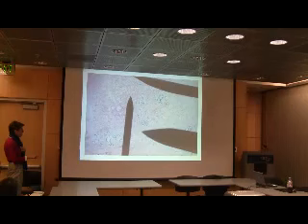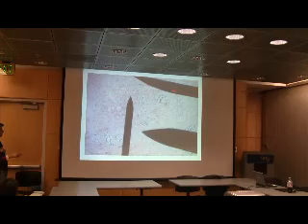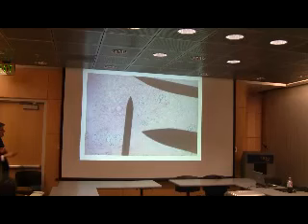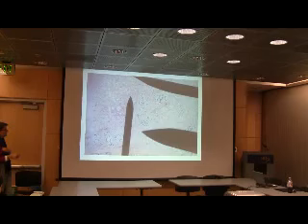And here there's a larger duct, for example. And needles are projected on top of this. This is a 23 gauge needle, and this is what we use most of the time for fine needle sampling. What we do is force this needle forward through the tissue. This particular example has a lot of the mesenchymal stromal component in it, and that's very difficult to remove with a needle, but the epithelial component is much less attached and will come out easier. So it's enriched in the fine needle biopsies. And the biopsy needle is wide enough that you can get a whole lobule out.